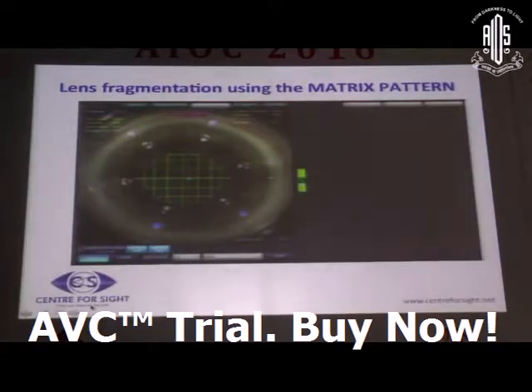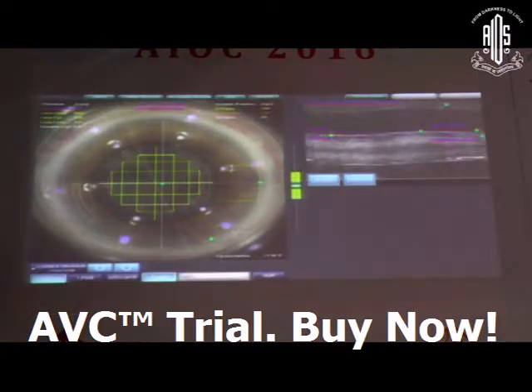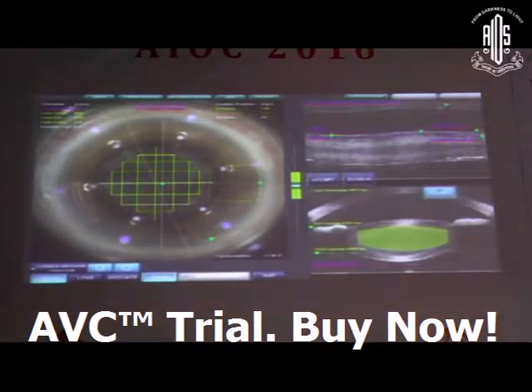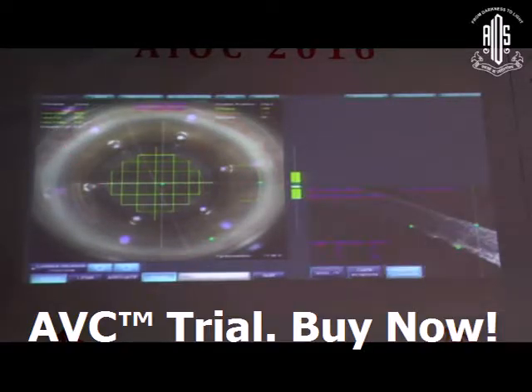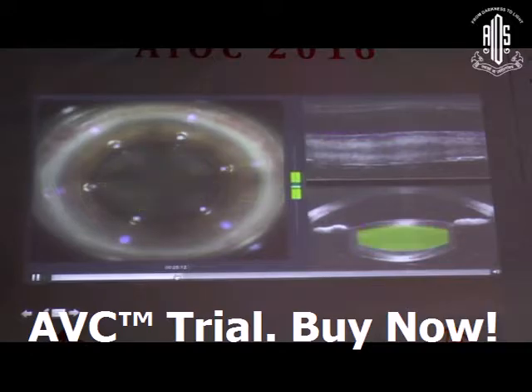Now let us move on to what I talked to you. This is the matrix pattern that you have. So here again you can see that these are the small cubicles. This is the OCT image that you have got. This is the amount of nucleus that you are going to fractionate. This is the LRI. So we go ahead and you can see that you press on the foot switch.